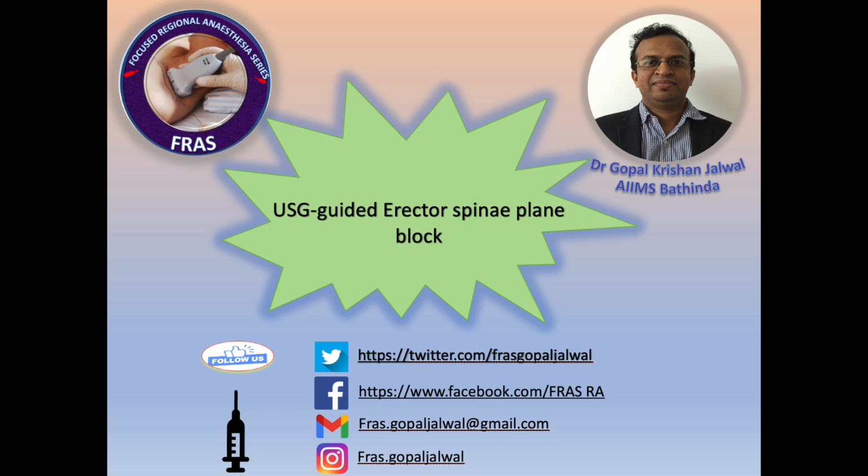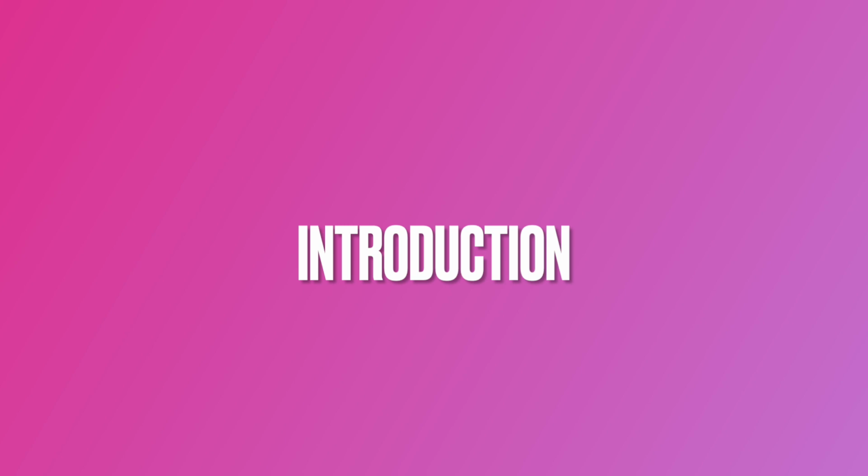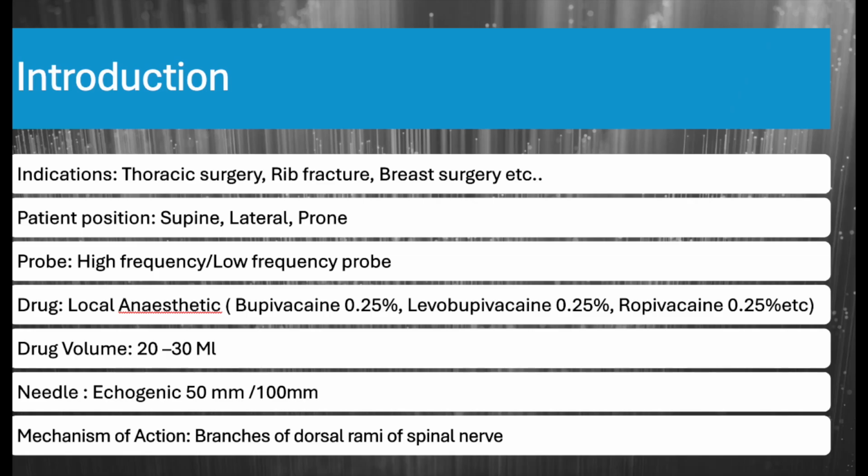In this video, I am going to demonstrate how you can perform the ultrasound guided erector spinae block. The erector spinae plane block is a fascial plane block and it can be performed from the cervical to the lumbar region for various indications, but the most common indications are thoracic surgery or rib fracture, breast surgery, laparoscopic cholecystectomy, etc. To perform the ESP block, the patient can be placed in supine, lateral or prone position.